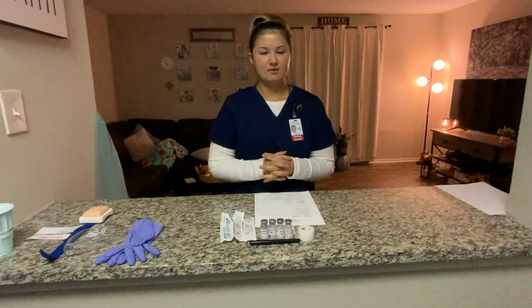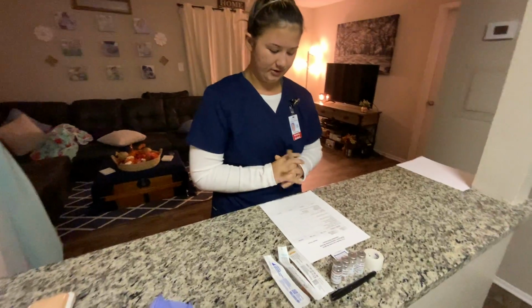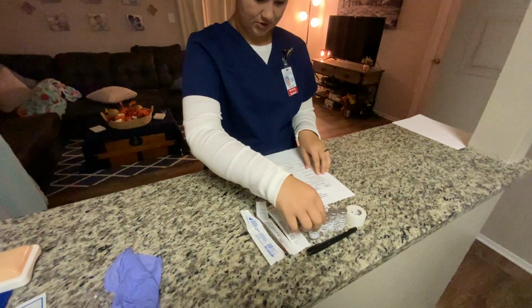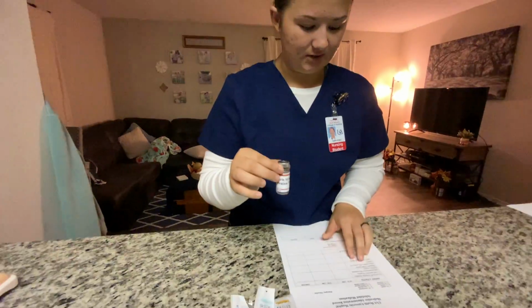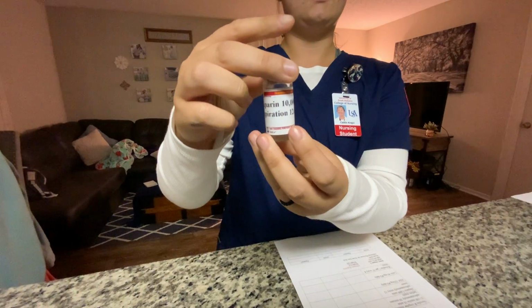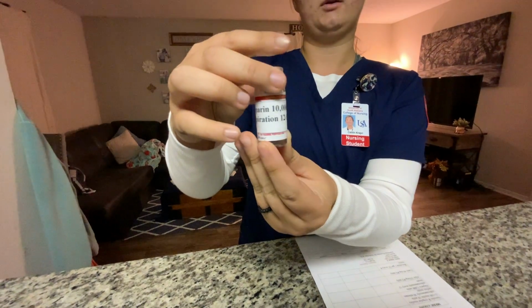So now I'm going to start my first check of rights. I am going to note that the patient's name is Jaguar J. Jones. I'm going to be administering heparin, in which I have heparin. And I'm going to be giving 5,000 units, so this is 10,000 units per 1 milliliter, which means I will be giving 0.5 milliliters. And I'm also going to note the expiration date is 12/5/25.